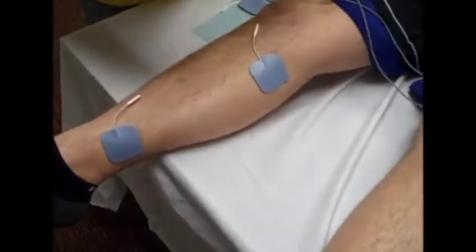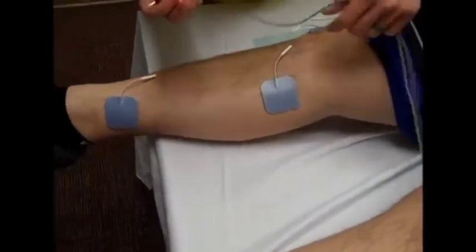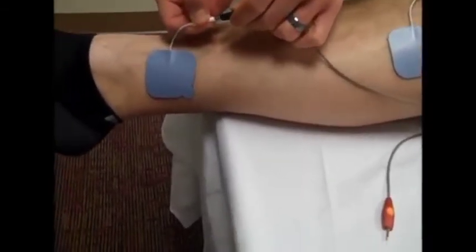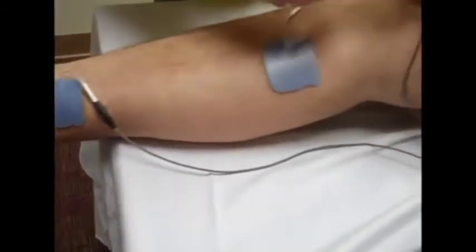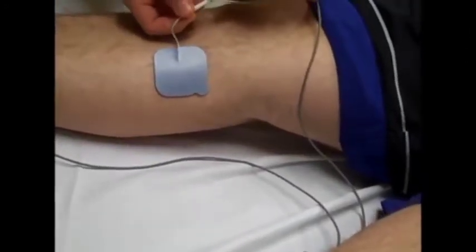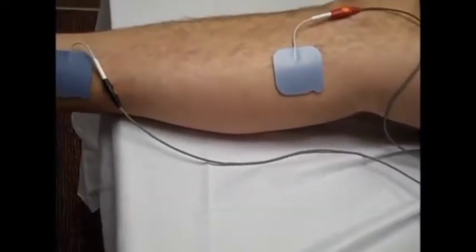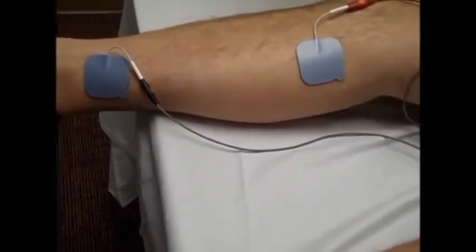And in the studies that they researched, they found that using a negative electrode as a treatment provided the best results, and then a positive electrode on the healthy viable tissue. So after performing these parameters, running the electrical stimulation for 45 to 60 minutes, there should be positive results after 4 weeks of treatment.